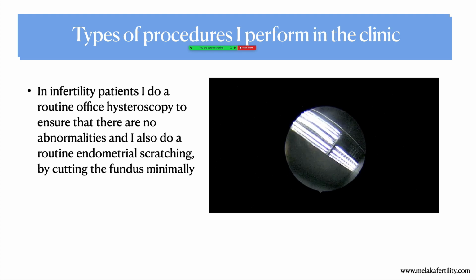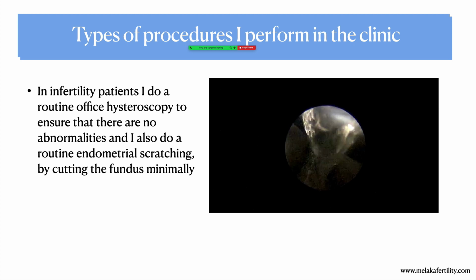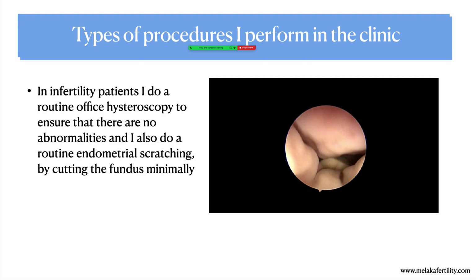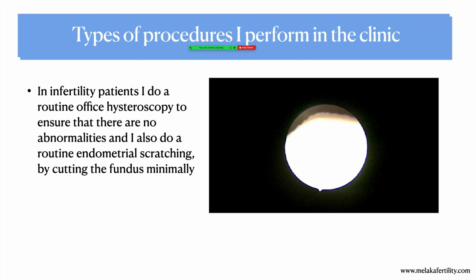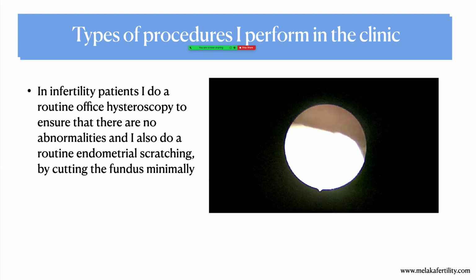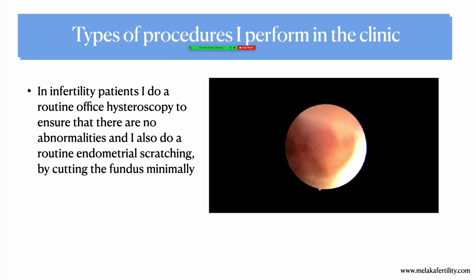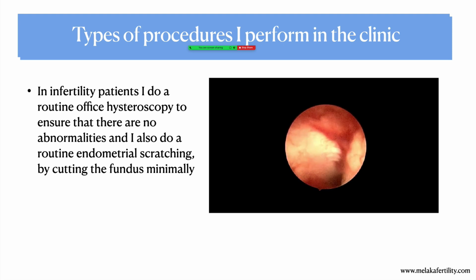So this is a 1.5 minute video showing exactly what happens during an infertility workup. The patient comes in, and I place a Cytotec tablet, and half an hour is sufficient. I go in with a no-touch technique into the cervical os. You can see the cervical os is small, and you go into the external os, and then into the internal os, and you're in the cavity.